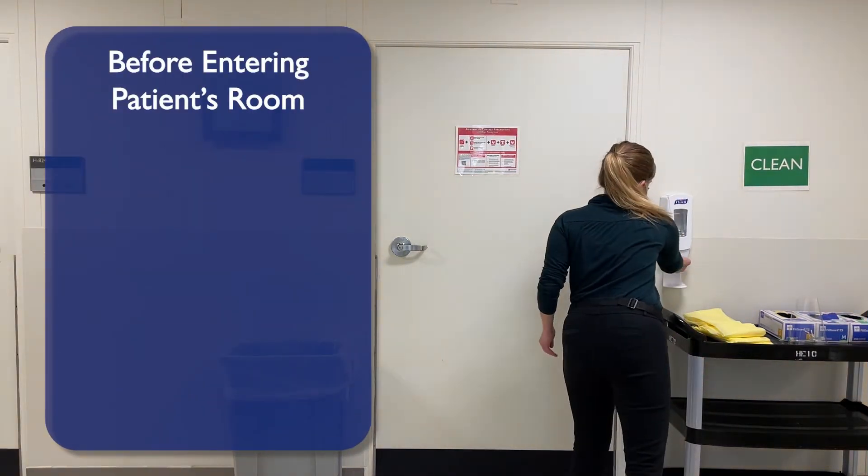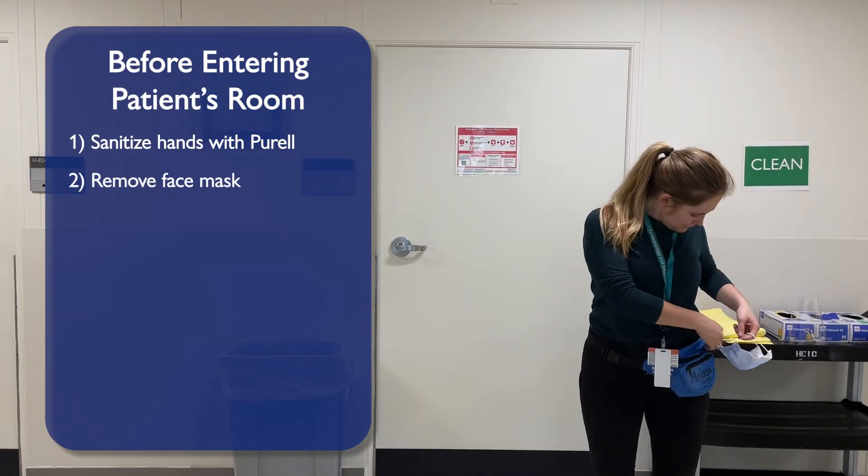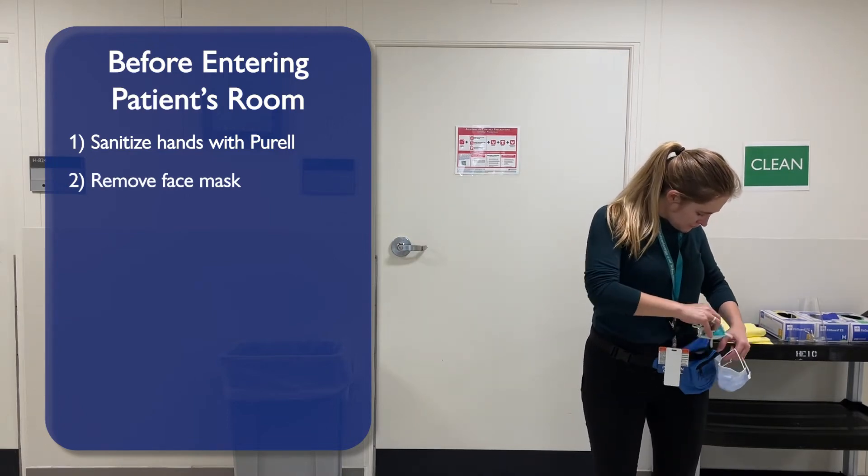Prior to entering the patient's room, sanitize your hands with Purell. Remove your face mask and discard or place it in your paper bag or P3 pack.